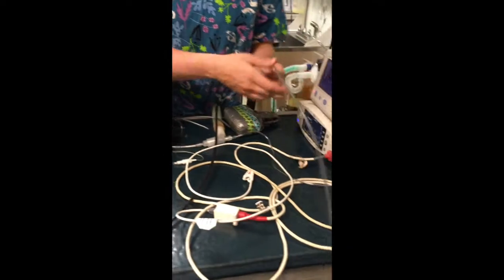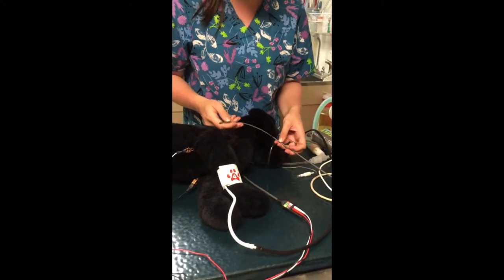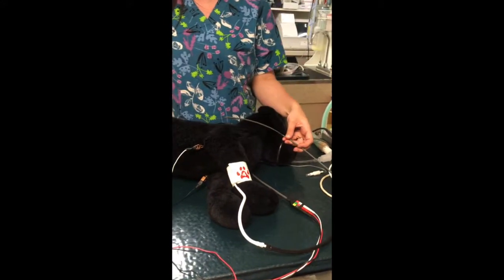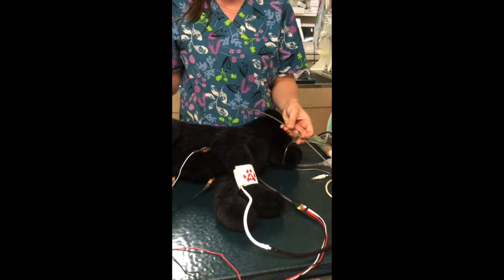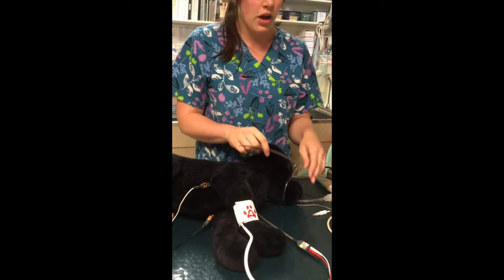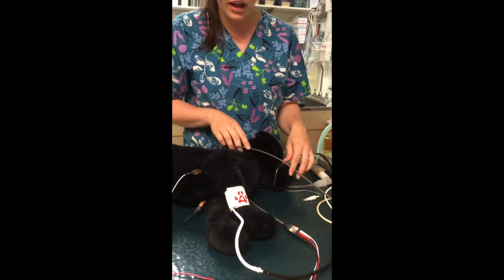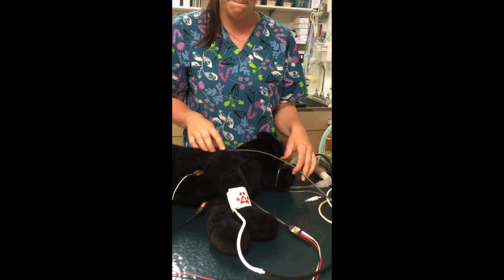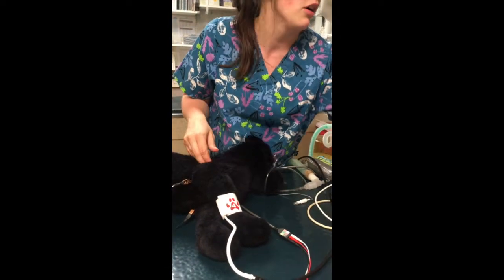Next, we have the esophageal temperature probe. So we can use an esophageal probe, or you can use a rectal probe for temperature. You may have trouble accessing the rectum during a surgery, so this is a good way to go. When you insert this, you want to insert it into the esophagus gently, about to mid-thorax, and that'll measure the internal temperature of the dog.